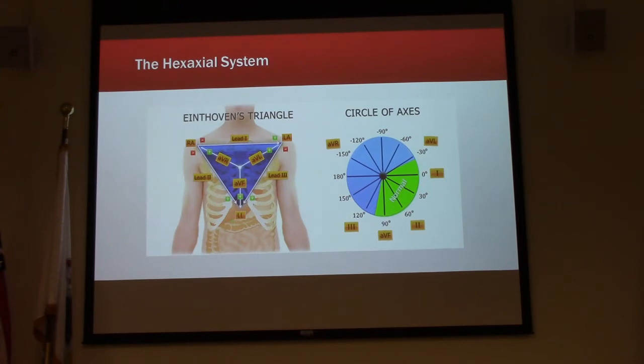The numbers don't lie. Our eyes can deceive us and make us see things that we don't necessarily see, or see different mimickers. Now, in a normal person, the electrical activity goes from that SA node down across our chest. It follows that natural electrical pathway, which is what looks at lead 2, which is why we look at lead 2, because it goes from this arm down to this area.